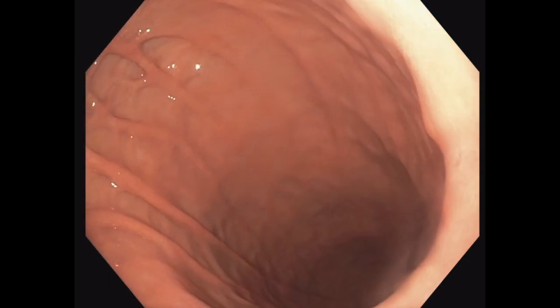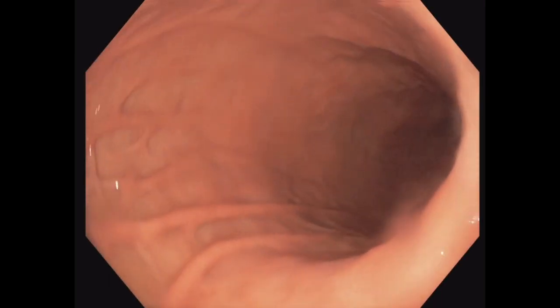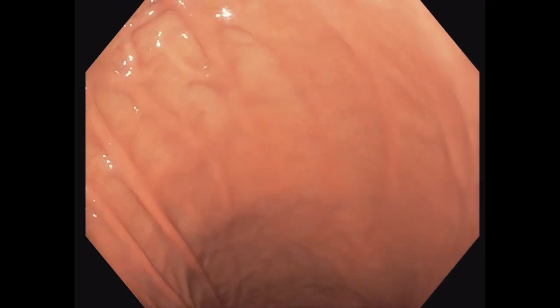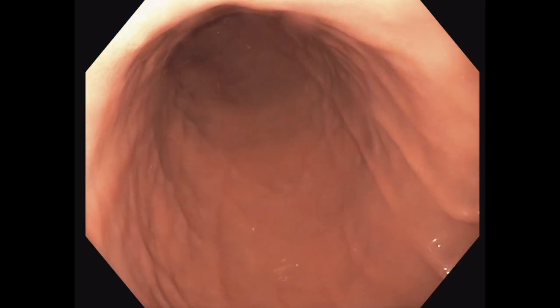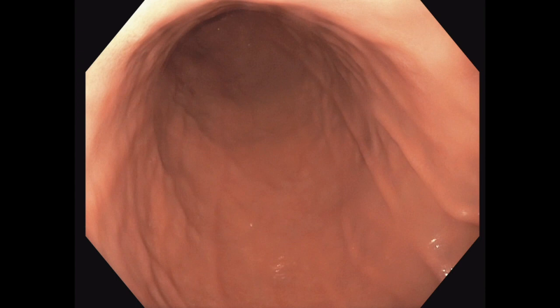The stomach has three parts: fundus, body, and antrum. Also, the proximal stomach within 2 cm distal to GE junction is called cardia. The gastric body is divided into upper, middle, and lower. The orientation is important to document the location of the lesions.